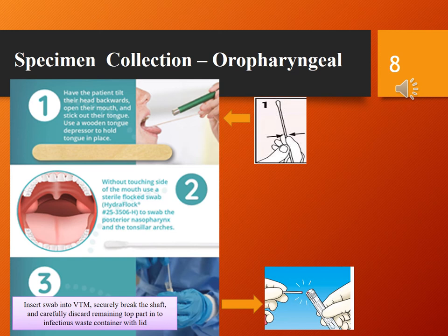Oropharyngeal specimen collection. Step 1: Have the patient tilt their head backwards, open their mouth and stick out their tongue. Use a wooden tongue depressor to hold the tongue in place.